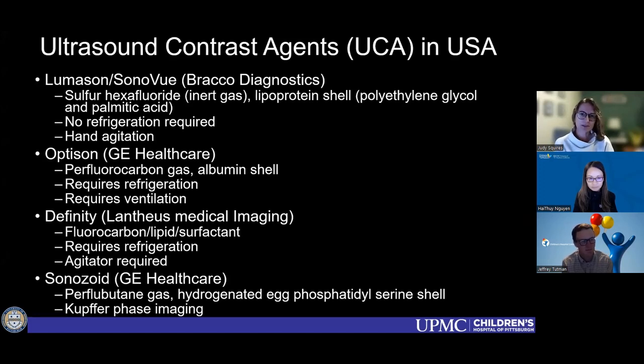The good thing about Lumason is that it's the easiest to use also. You get beautiful enhancement or perceived enhancement. You don't have to refrigerate the contrast agent, which, if you have to refrigerate a medication in radiology, means a lot more hoops to jump through, like monitoring the temperature, recording the temperature, stuff like that. And then you just hand inject the solution to reconstitute and make the contrast up.